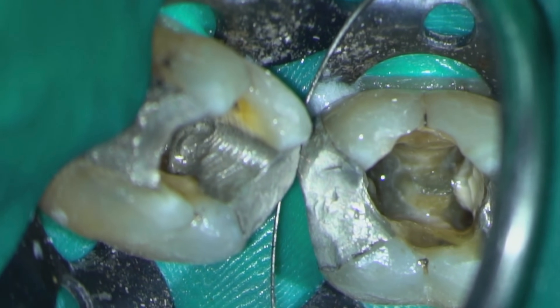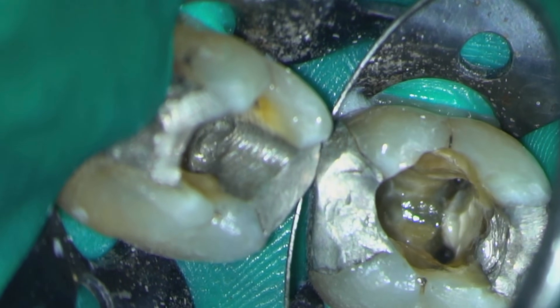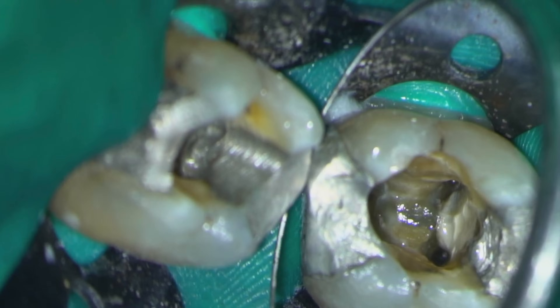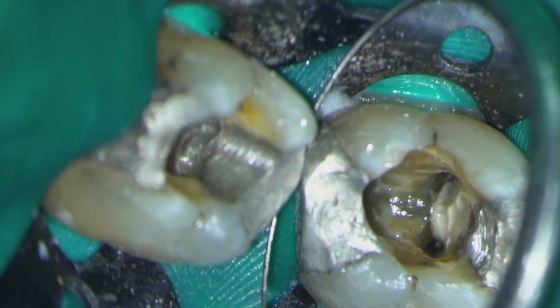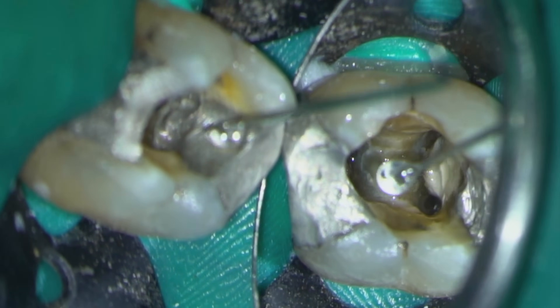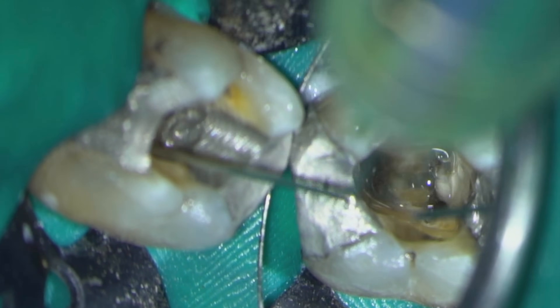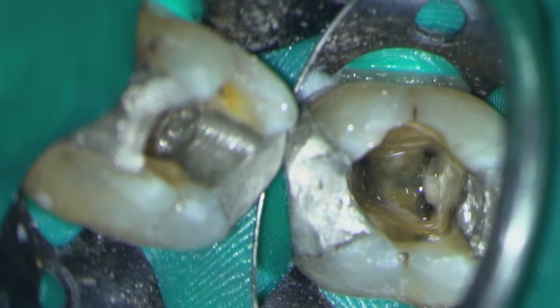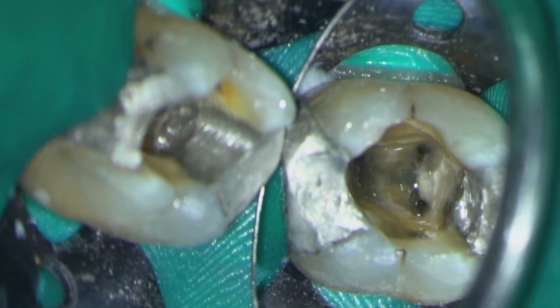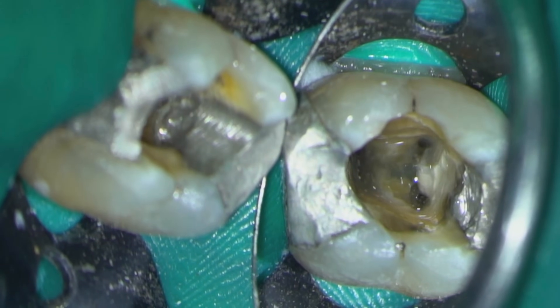A quick flush of the access with 3% sodium hypochlorite, and then I'm just going to refine the orifices of the root canals with the ProTaper SX instrument, being careful that the tip doesn't engage any obstruction, certainly in those mesial canals.